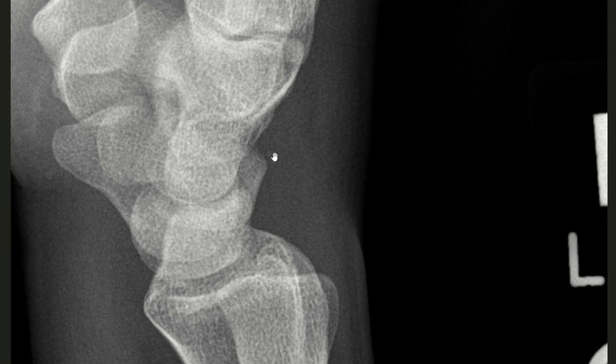In the lateral view this is called the pooping duck sign, with the scaphoid forming the head of the duck, the lunate the body, the dorsal part of the triquetrum the tail, and the avulsed piece the poop.